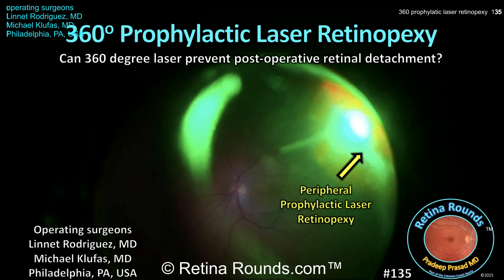Retina Rounds, episode number 135: 360-degree prophylactic laser retinopexy. Retinal detachment is a feared complication following pars plana vitrectomy — whether a re-detachment following primary retinal detachment repair or a new retinal detachment following vitrectomy for other indications. 360-degree prophylactic peripheral laser has been proposed as a technique to decrease the risk of postoperative retinal detachment.